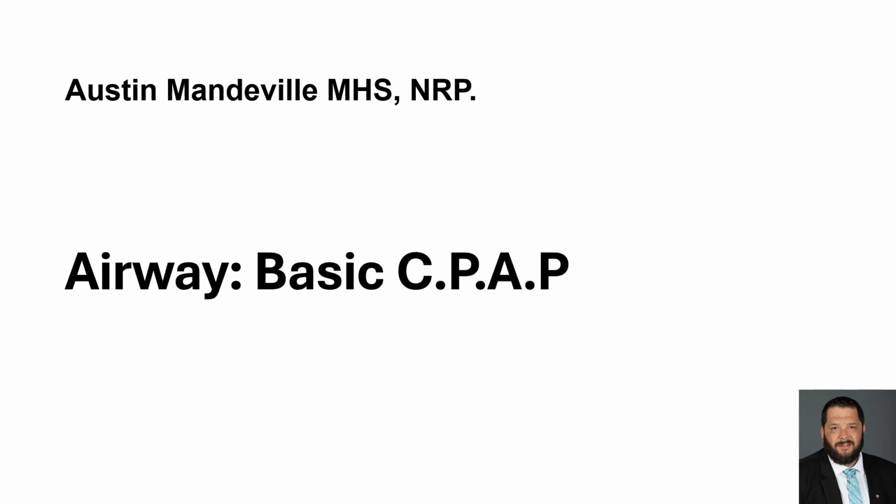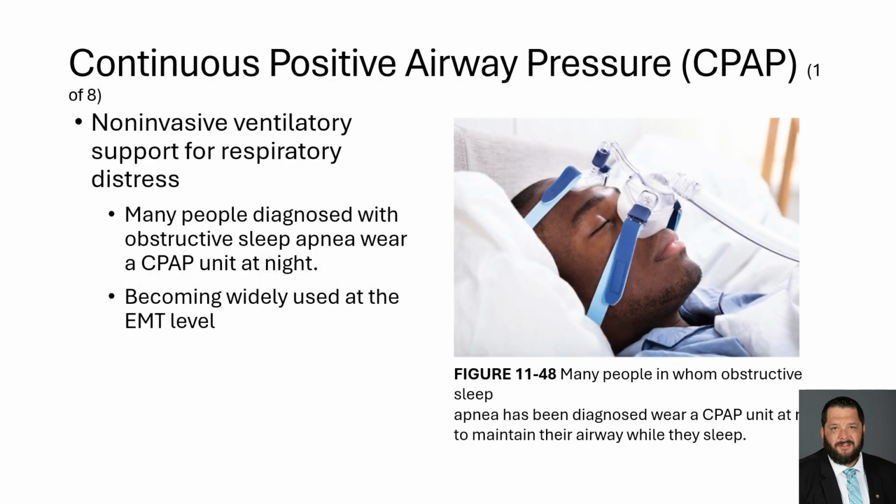Welcome back. We're going to continue our airway discussion with the use of CPAP. CPAP is an acronym that stands for Continuous Positive Airway Pressure. It's a tool used in EMS as a non-invasive ventilatory support tool for patients experiencing respiratory distress. Many patients use CPAP at home for conditions such as sleep apnea, but it's more widely becoming used in the pre-hospital setting, specifically at the EMT level, for patients with congestive heart failure, asthma, or other significant respiratory events.